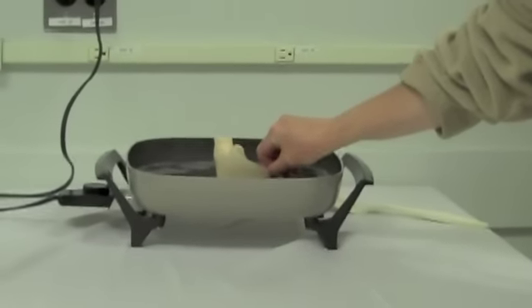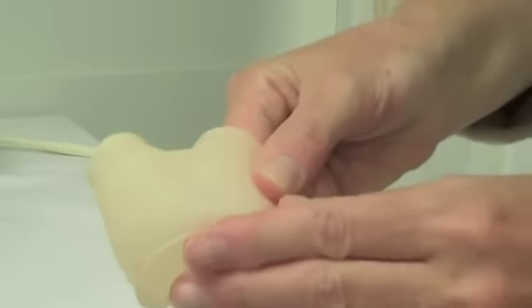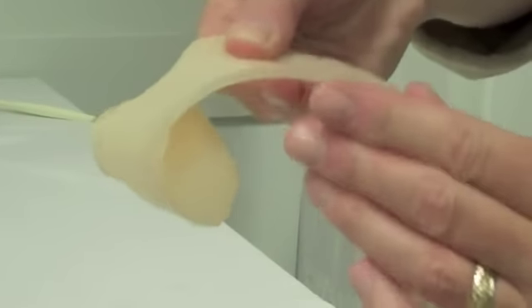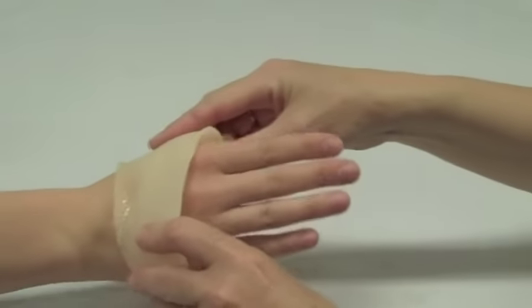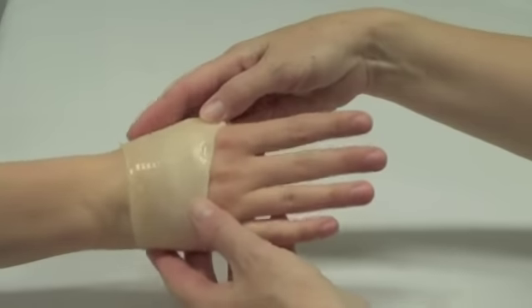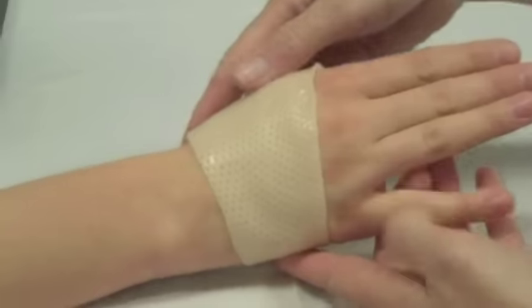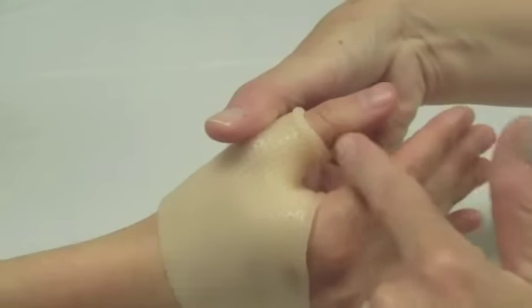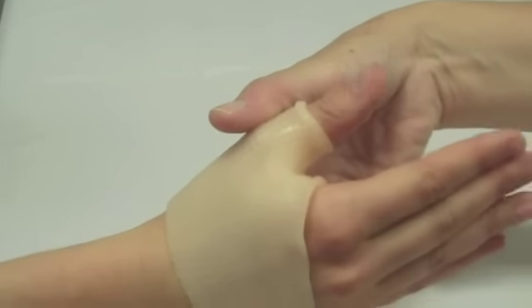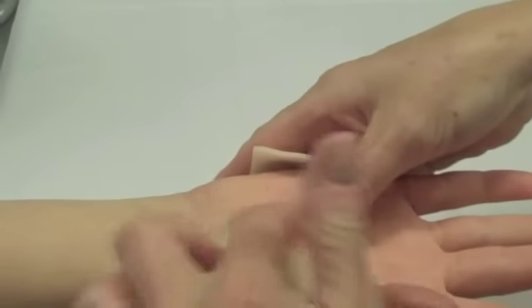Dip the bottom of the splint back into the water bath so that you can flare the softened edge. Gently slide the splint onto the patient's hand. Make sure the splint does not block wrist extension. Make sure that the splint clears the crease of the IP joint so that flexion is possible. Make sure that the thenar eminence is covered as well.